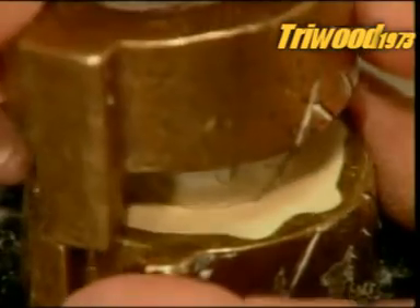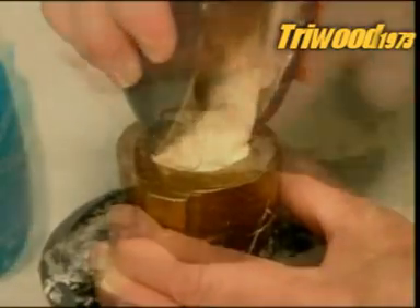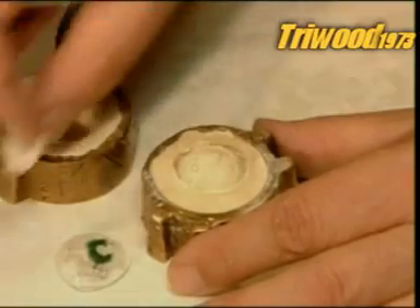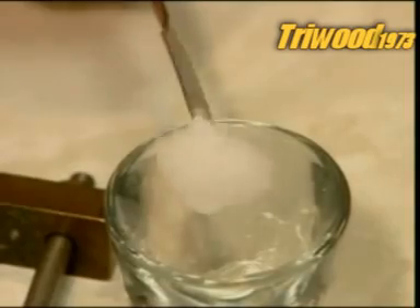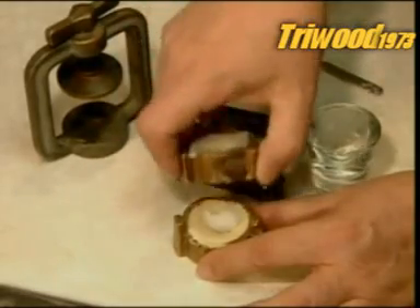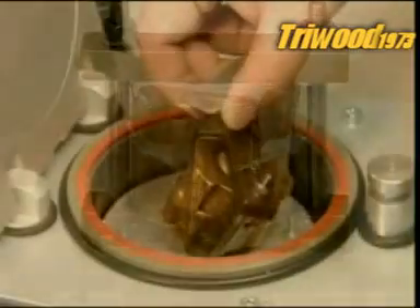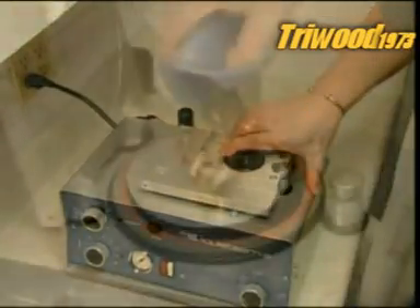They place the impression in a mould and pour in a type of plaster. When the plaster has hardened, they remove the impression tray, and then the impression itself. What's left in the mould is a plaster replica of the socket. Now they put a wand of acrylic plastic dough into the mould, lock the mould into a press, and submerge it in a high-pressure curing unit for 25 minutes. Then they cool the mould in cold water.